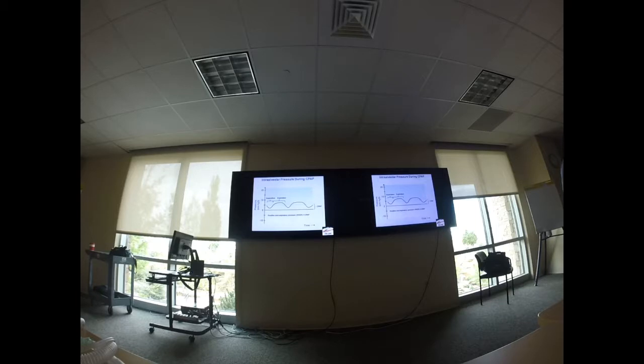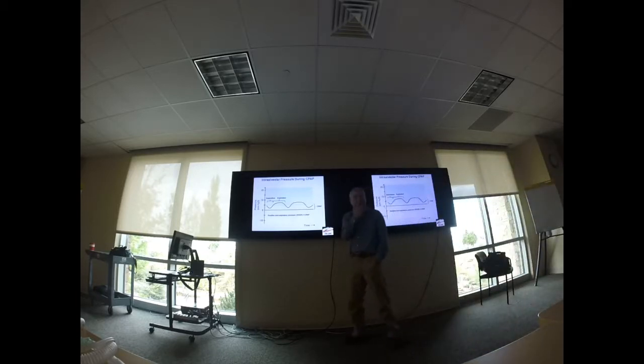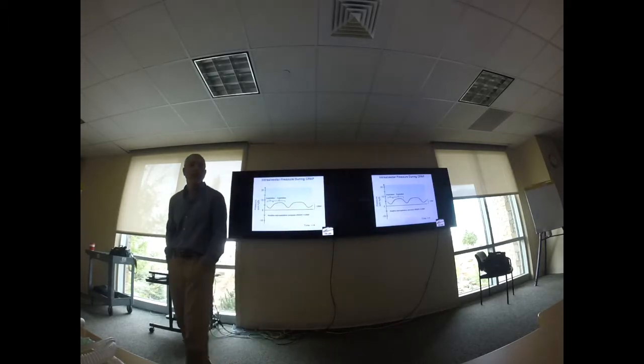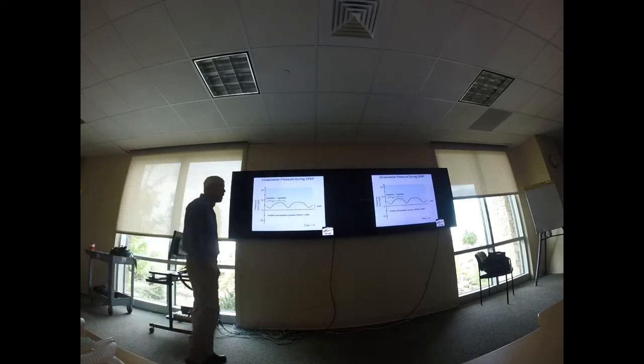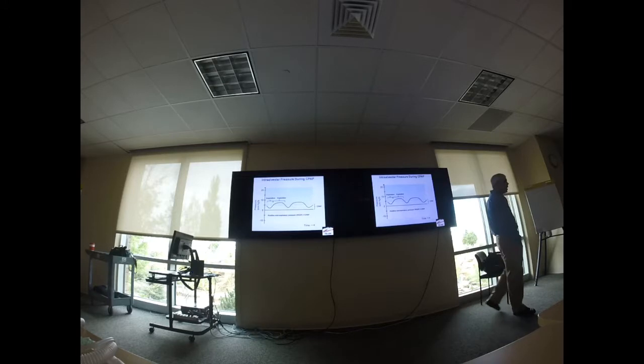What kind of patient would you use CPAP on, I guess? CHF. Yeah. So a hypoxic emergency, right? Somebody who's got hypoxia is where I would use CPAP, right? Knowing that I would use it on a hypoxic failure or hypoxic emergency, that's a CHF patient, congestive heart failure, is who I usually think of.